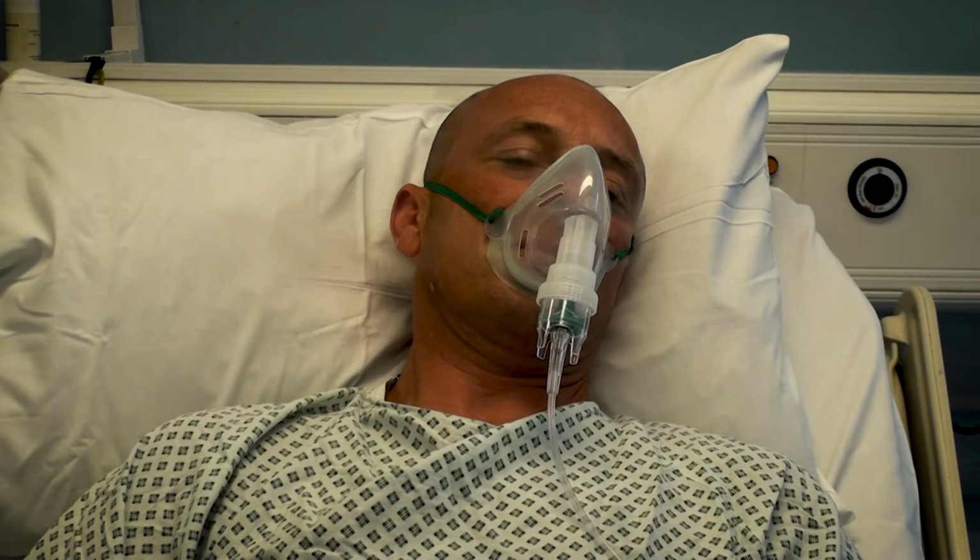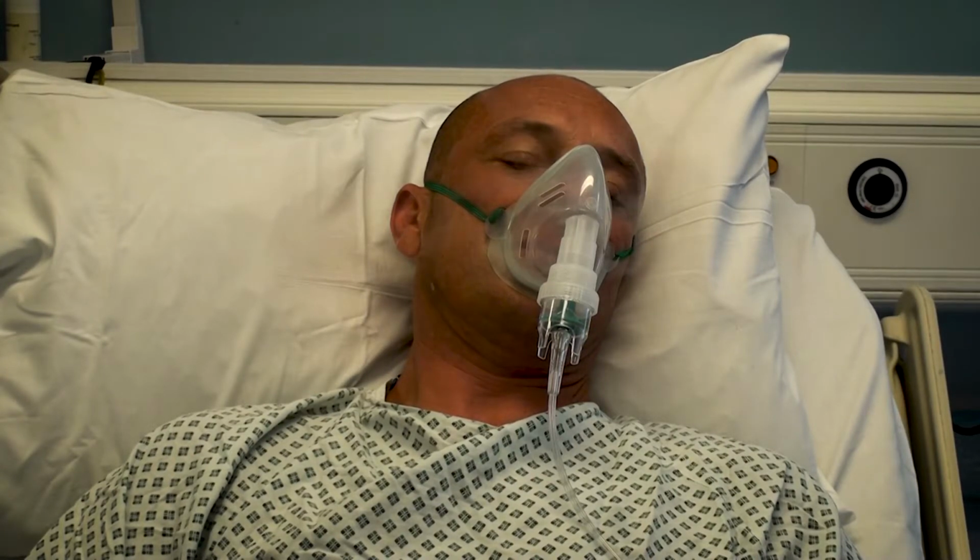Sometimes you may need to tap slightly on the nebulizer mask as the droplets of the vapour drug rise to the top of the chamber. Once the nebulizer is complete, dispose of all equipment appropriately. Nebulizer masks and chambers can be kept for up to 24 hours and reused and cleaned in between use, but for single patient use only. Ensure the patient's welfare after the procedure.